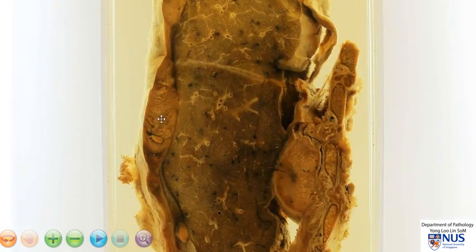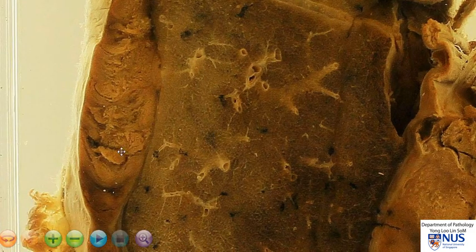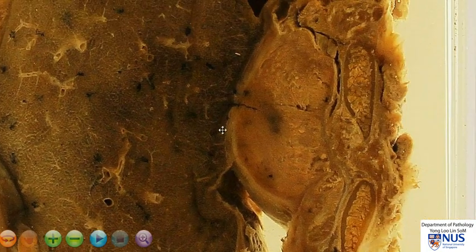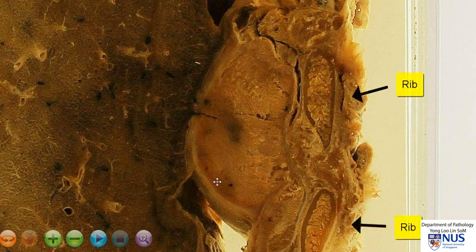Let's just follow the rest of the specimen. You can see that there's a nodular area here and possibly some necrosis with these paler geographic areas. I'm outlining one here. And as we move down again, we see this nodularity. And over here, there is a thicker area of tumor.